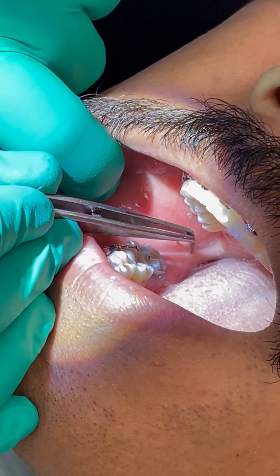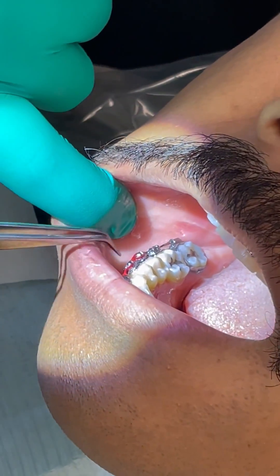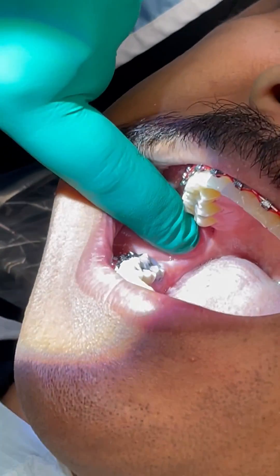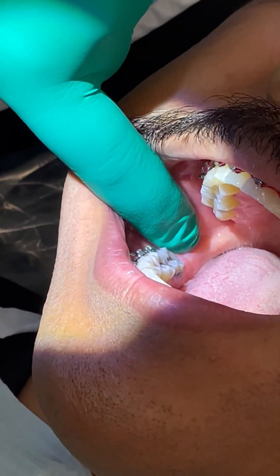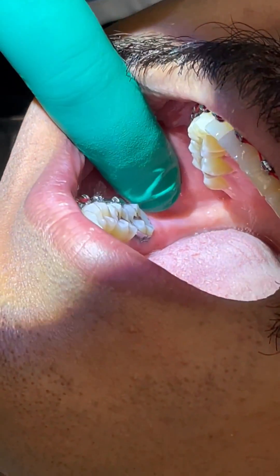The long buccal nerve runs from the inside, up and over, and down all this area here. What you're looking for is the internal oblique ridge and the external ridge — you can feel them, run your finger across, and feel where those ridges run parallel to each other.